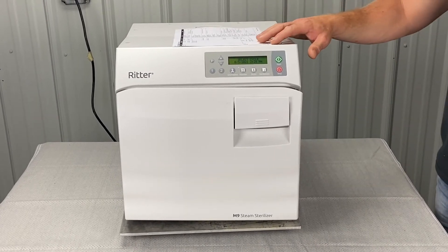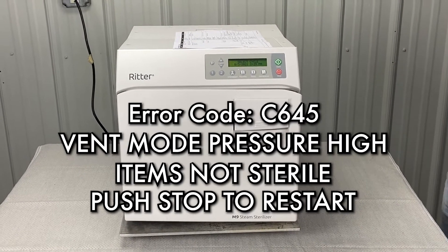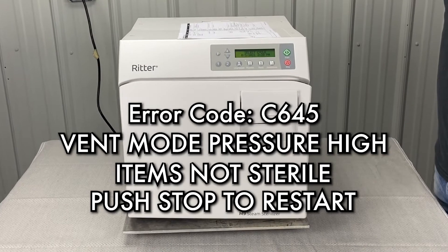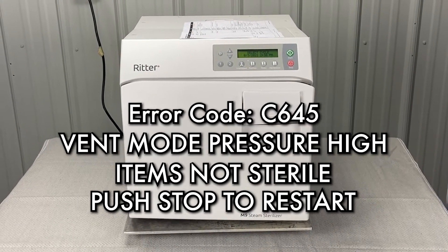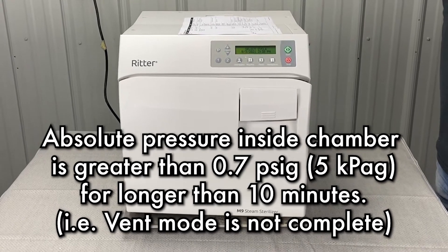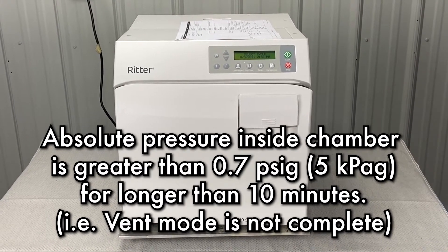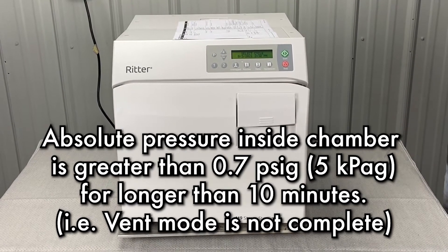We're going to talk about error code Charlie 645 — vent mode pressure high. Items not sterile, push stop to restart. Absolute pressure inside the chamber is greater than 0.7 PSI for longer than 10 minutes. Vent mode is not complete.